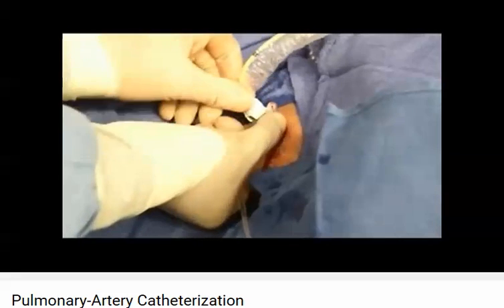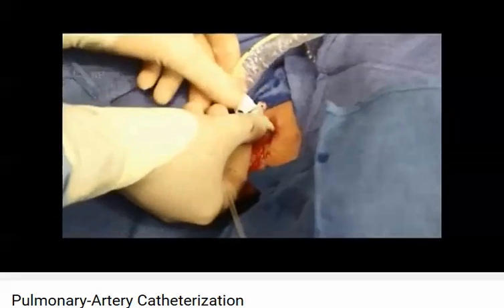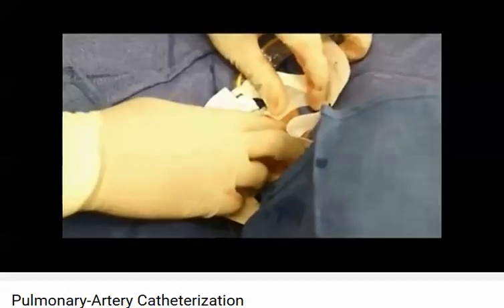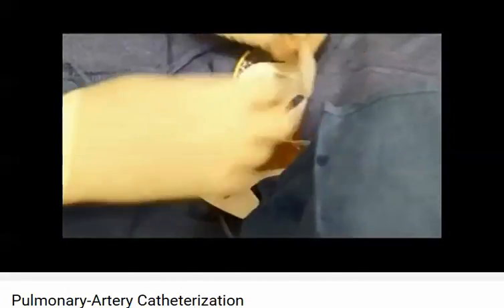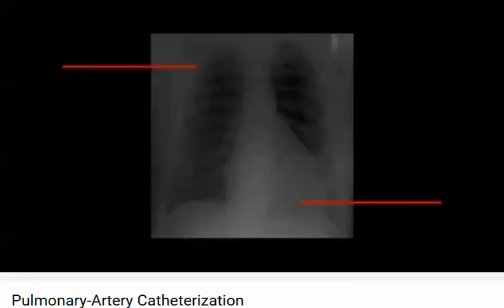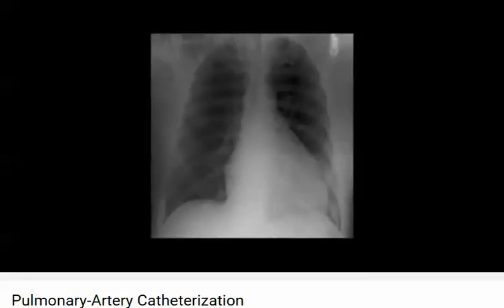Fasten the plastic sleeve to the sheath and secure the catheter. Suture the sheath to the skin and apply an antibiotic-impregnated adhesive dressing over the wound. Obtain a portable chest radiograph to confirm appropriate positioning of the catheter and to rule out a pneumothorax.